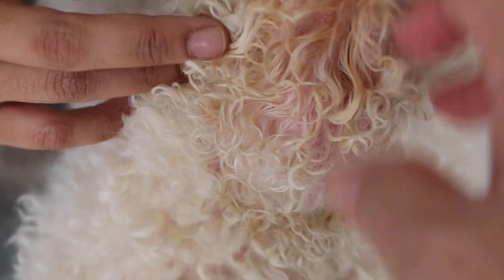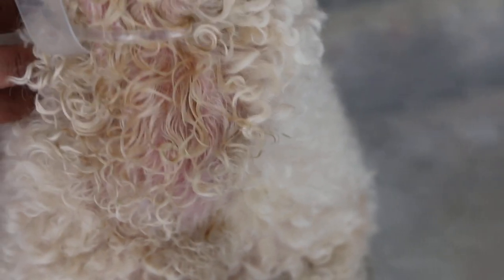Make sure it's loose. Always remember, don't keep changing — have a system, have a good system. If you keep forgetting, there'll be problems. You can see the rashes are really due to the dog scratching.